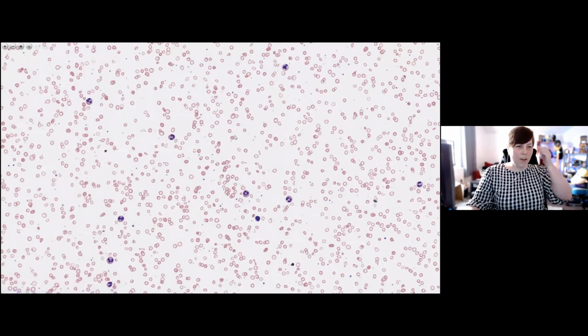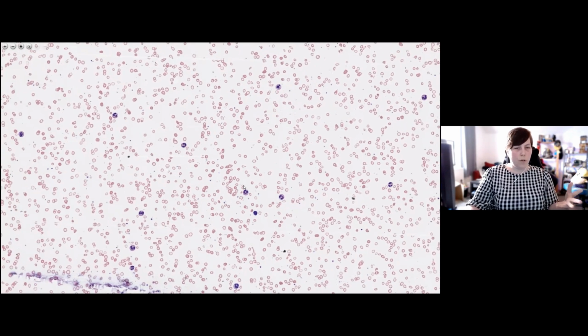Excellent. All right, so we've been told that this is a young female patient and they have a hemoglobin of 68. So the first thing that I would look for in reviewing this film is, does what we're seeing on the film match a hemoglobin of 68? The answer, I think, unequivocally is yes.